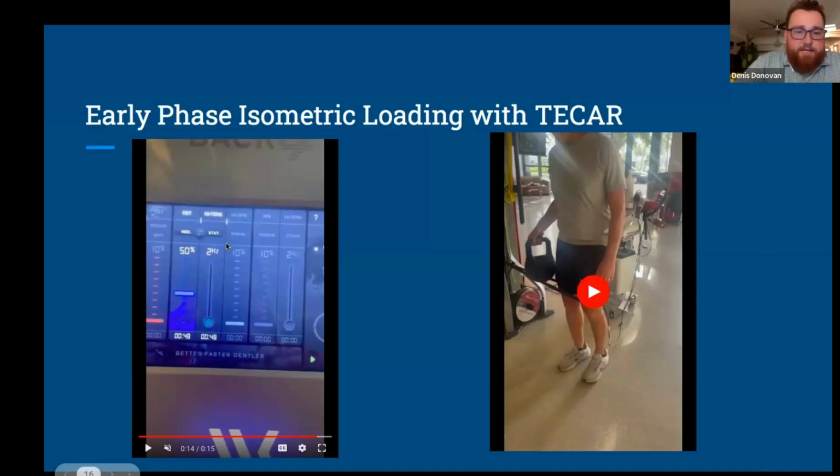So 50% heat, I'm running it at the same time as the high tens. Most of what I do is this way, with the resistive current running at the high tens at the same time. I find it great for just toggling to that, the deepest current you're going to get, reaching all the resistive tissue as well as the bone, tendon, ligament, and cartilage.